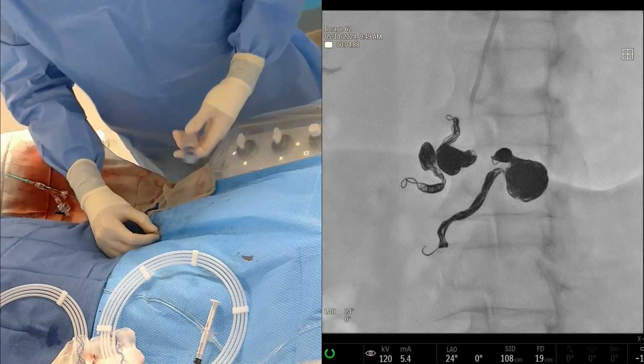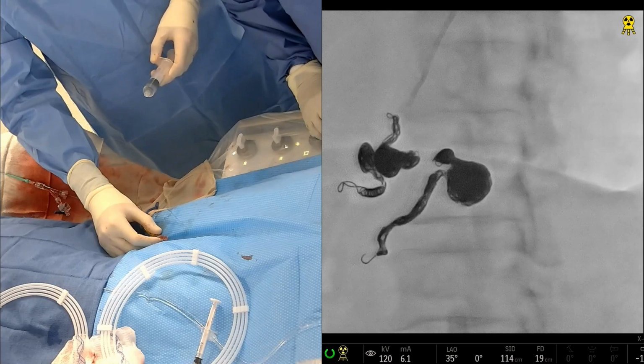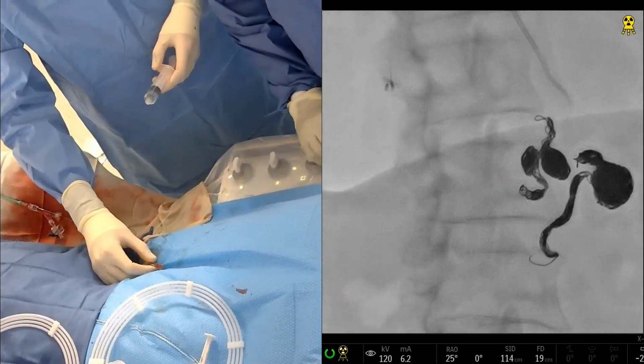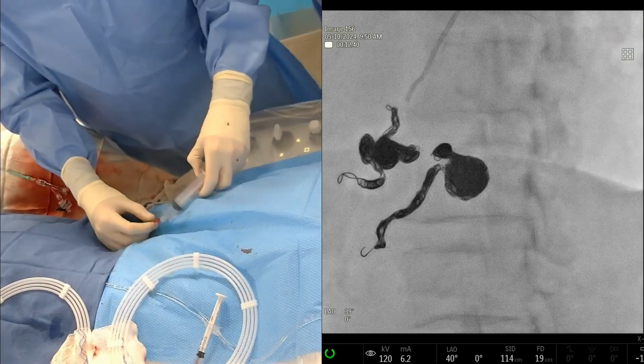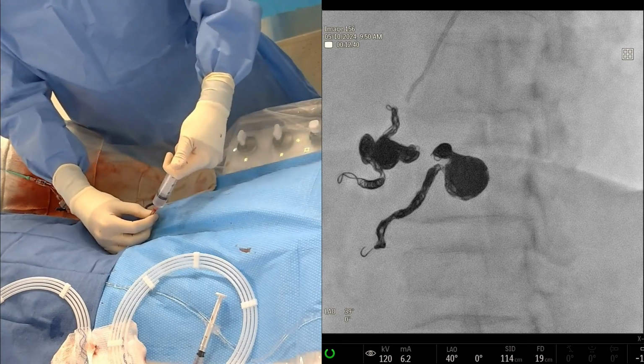But it's almost like there's an infundibulum going into the aneurysm, right? Yep, that's what it almost looks like. We're just going to do a little swing by and see. Yeah, that's really cool. You see how the view is important, right? Because you couldn't see that as clearly otherwise.